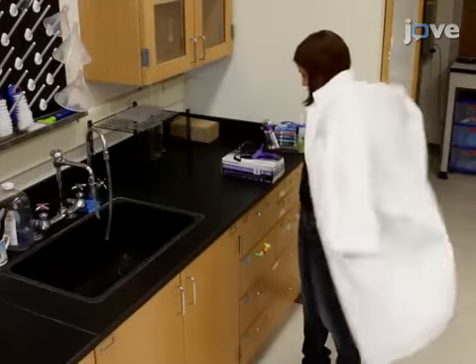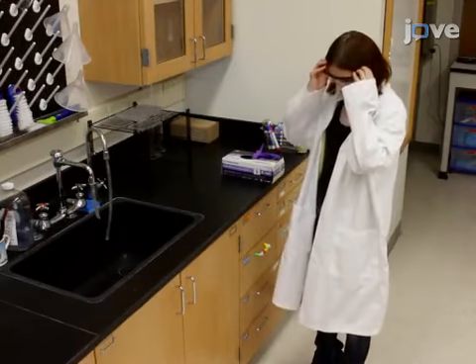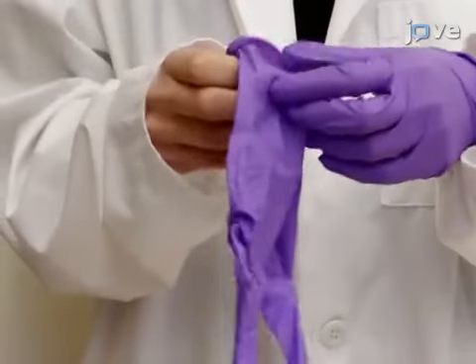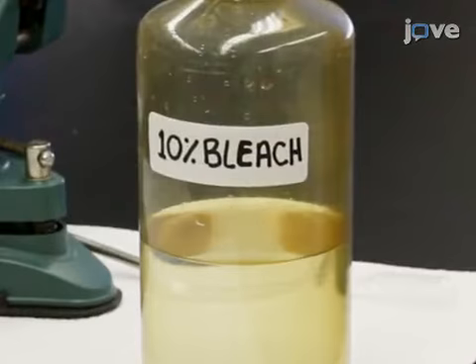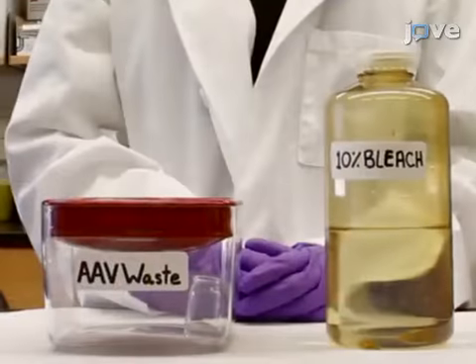Ensure that all institutional precautions for working with adeno-associated viruses are followed throughout. The virus used in this video is classified as a Biosafety Level 1 compound. Prepare a 10% bleach solution for decontaminating AAV waste.